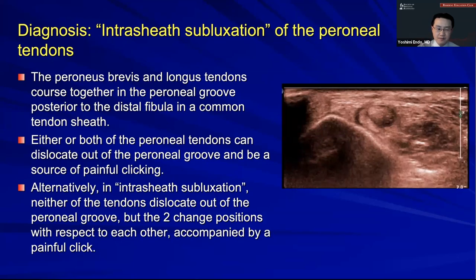So the classic condition is one or both of these dislocating out of the peroneal groove and causing a painful clicking. But if these two switch positions, but both of them stay behind or along the peroneal groove, that's called intra-sheath subluxation. This is something the surgeon would want to know if planning to operate on these patients, to know exactly what is snapping, what is dislocating, and what is subluxating.